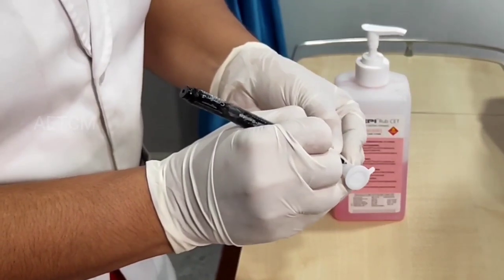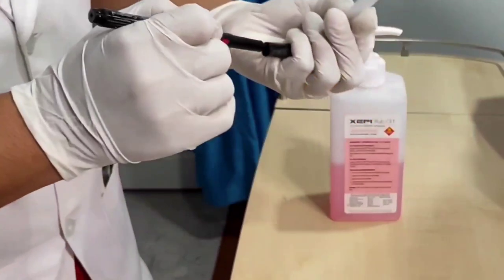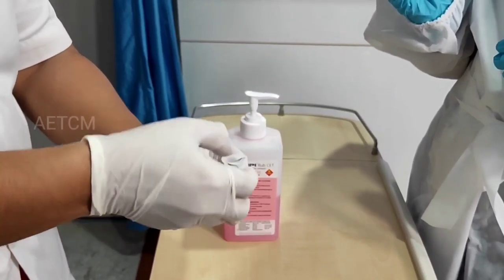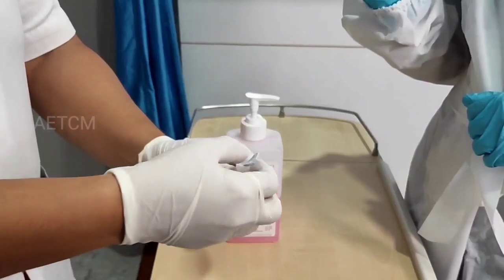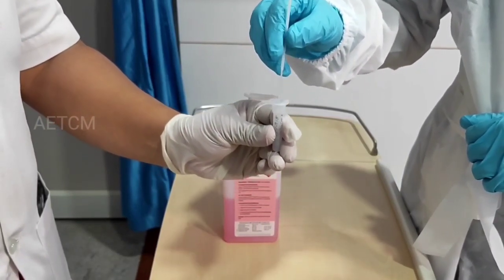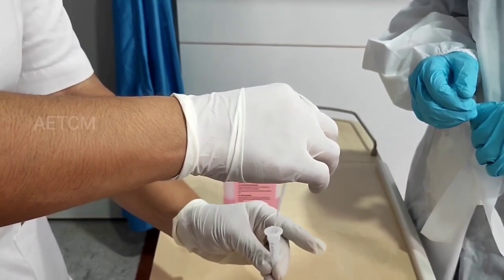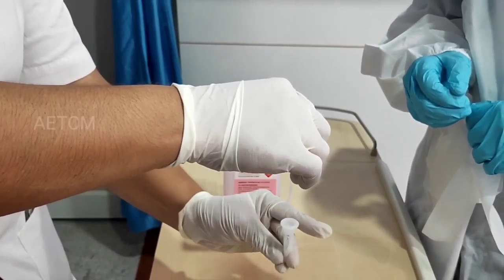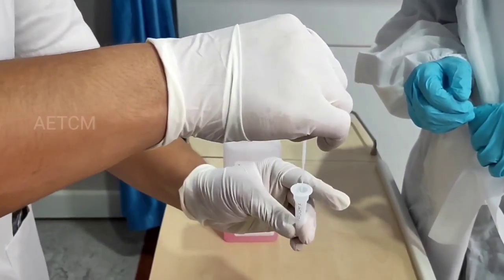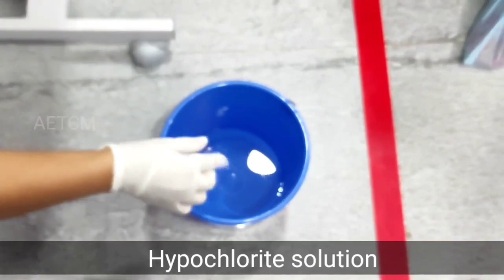Make sure you have written the name and card number of the patient over the extraction buffer tube. Open the extraction buffer tube and insert the swab into the tube. Once this step is done, stir the swab more than five times while squeezing the buffer tube. Remove the swab while squeezing the sides of the tube to extract the liquid from the swab. Dispose the swab in 1% hypochlorite solution after the procedure.